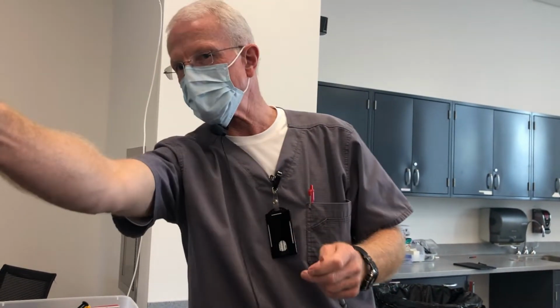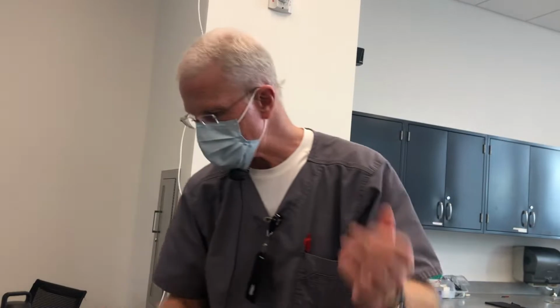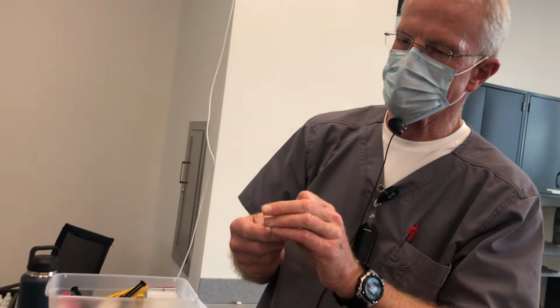There we go. And so what's the problem? Also, you've got to get the edges of these really clean. So not only the flat spots, but the edge. And so what is the problem with leaving little chunks? If it breaks off, it'll break off in the cement. I said if it breaks off, it'll break off in your cement. You got a boulder in your concrete. And now you got to seat whatever it is you're seating, and the boulder's going to get in the way. You're exactly right. So clean off your spatulas on all sides, 1, 2, 3, 4, 5 sides, right? Plus the end.